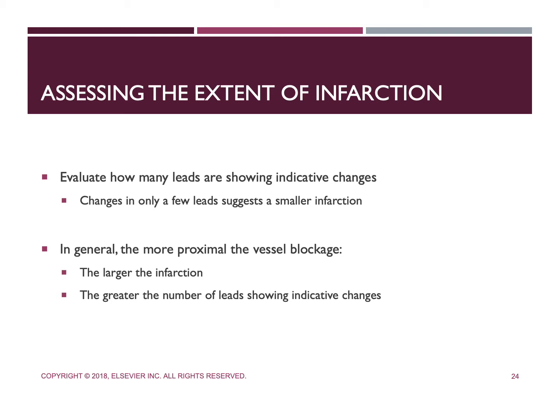However, when we get into ST segment depression as well as T wave changes that suggest the presence of an MI or myocardial ischemia, as in non-ST elevation acute coronary syndromes, they are going to be less reliable in localizing the culprit vessel, mainly because the ECG changes reflect subendocardial rather than transmural ischemia.